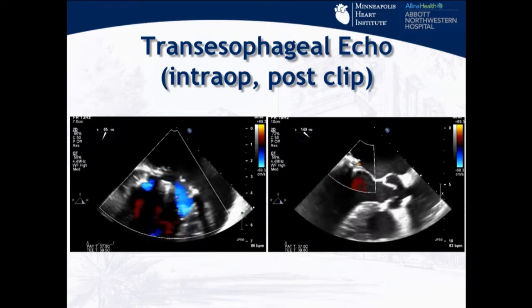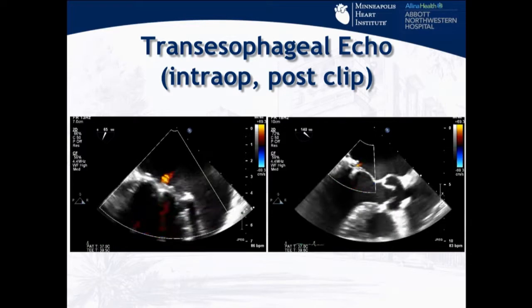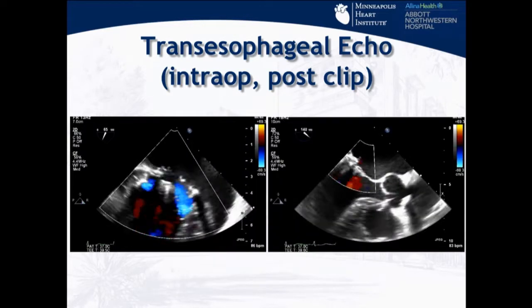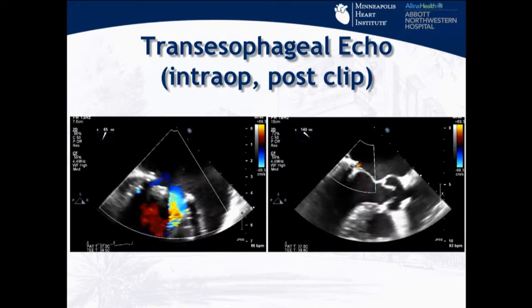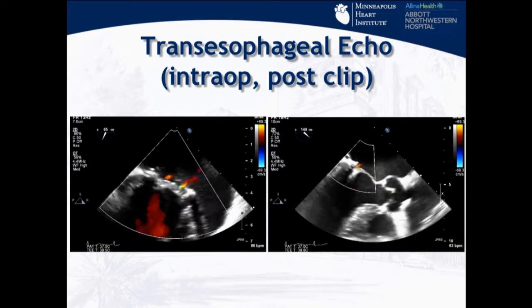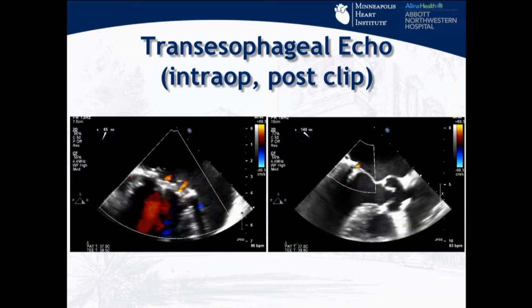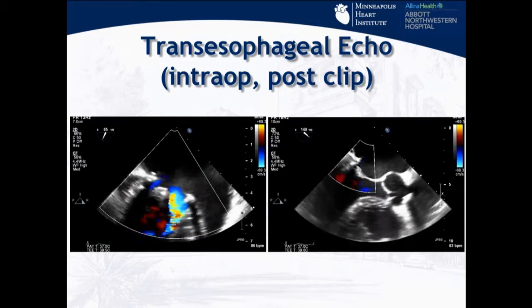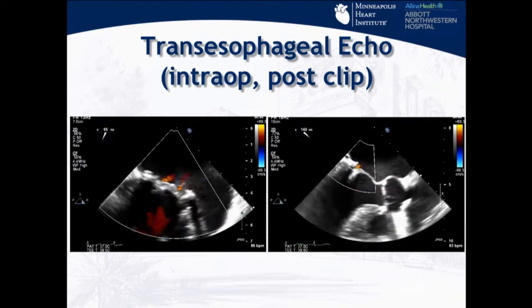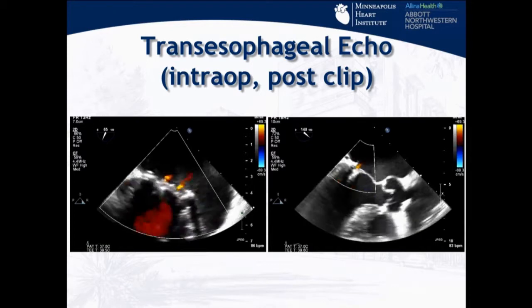Have you ever tried to close one of these on a ring, just on? Yeah, so it's on the ring. And do you have a fluoro image or anything? I don't think so. But essentially you just grab whatever tissue you can grab. There is very little posterior leaflet there to grab, and just pull it against the annuloplasty ring. And we've done this on 2 occasions, so it's worked relatively well. The transseptal has to be very posterior, because you're going to want to drag things posterior when you do it.